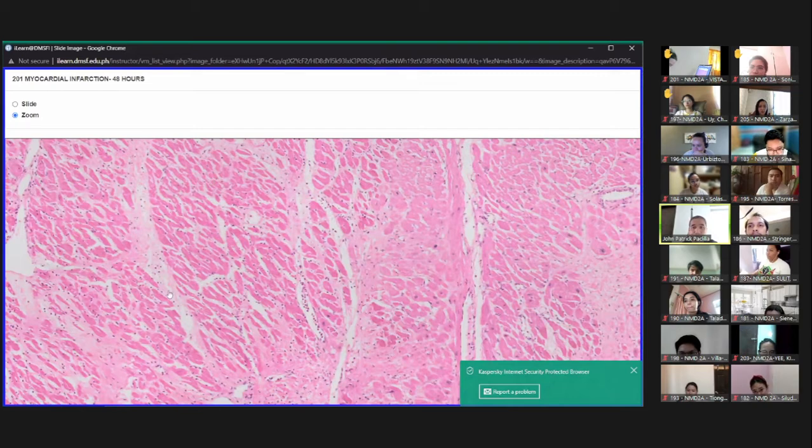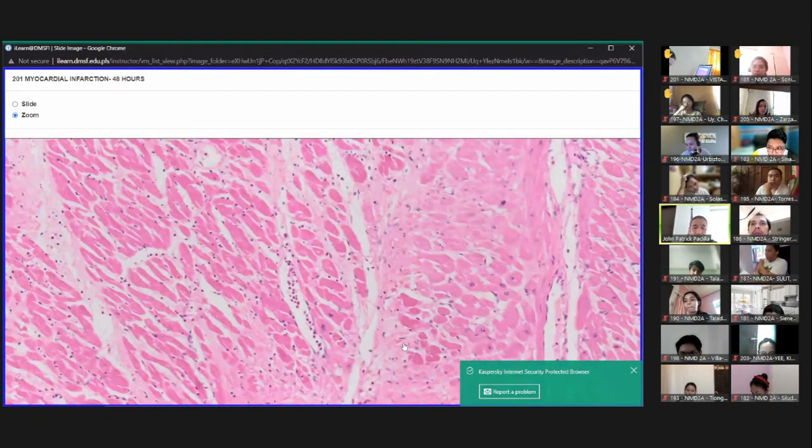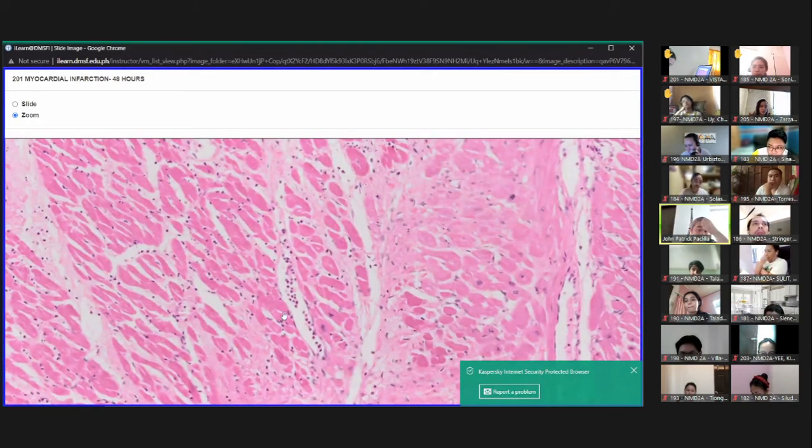What's the difference? Change in the color. Darker, lighter. Okay, scanning view. You can see a lot of inflammatory cells in this particular area. Less, di ba? And then lastly would be the presence of nuclear features. Okay, dito, meron tayong nuclear feature. Absence of nuclear features.